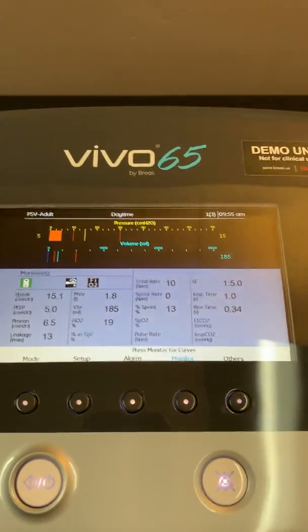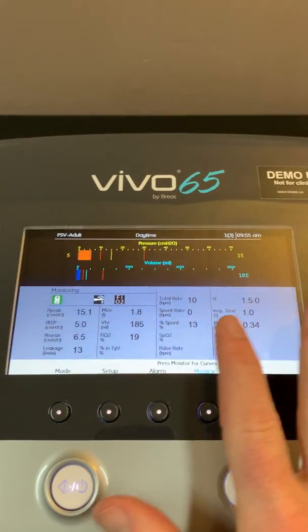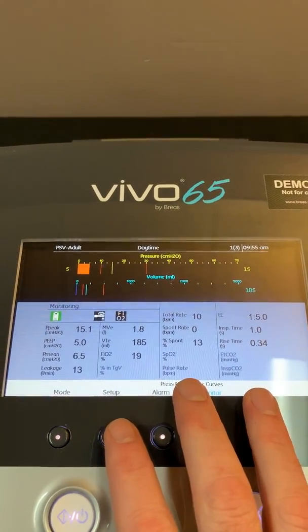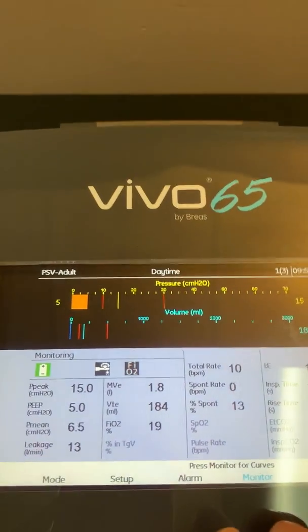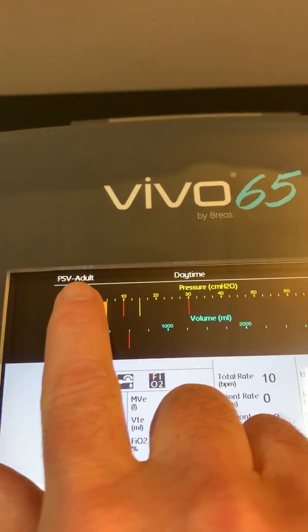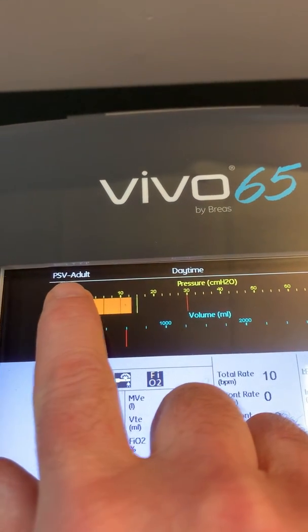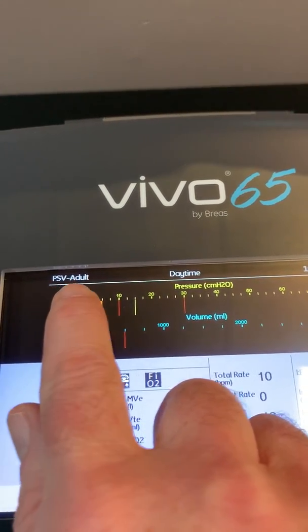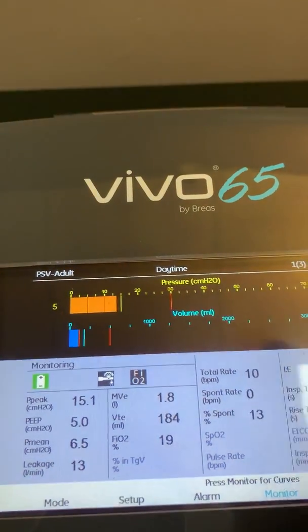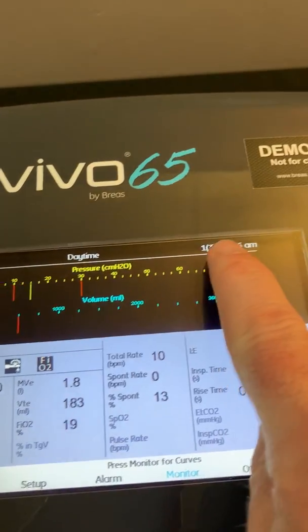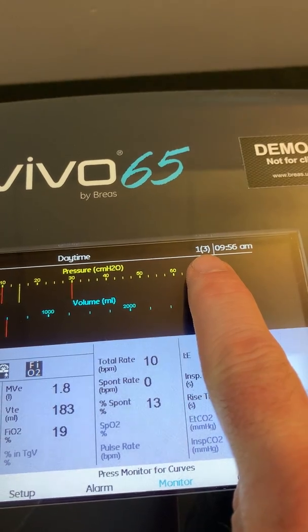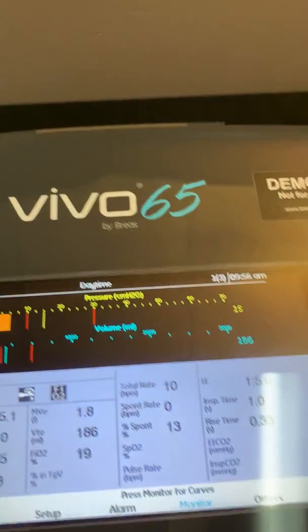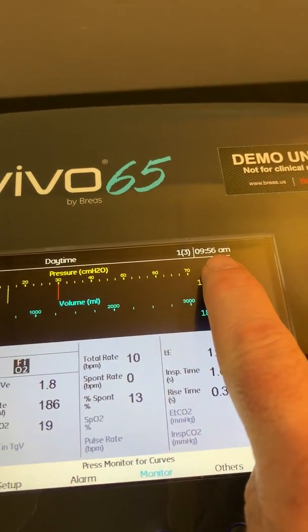The main monitoring screen shows all your main measured values coming from the patient. In the upper left-hand corner you'll see the mode of ventilation — currently pressure support ventilation in the adult patient mode, daytime profile, page one of three pages of monitoring, and the current time.